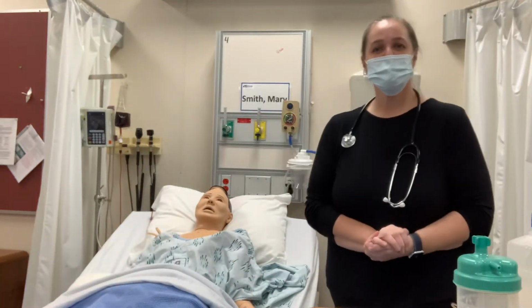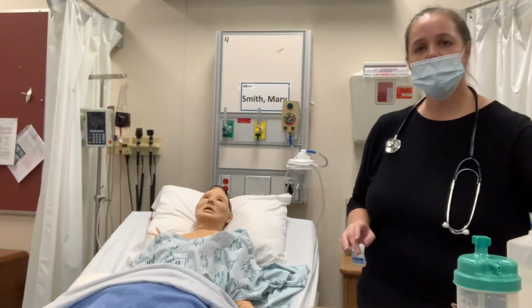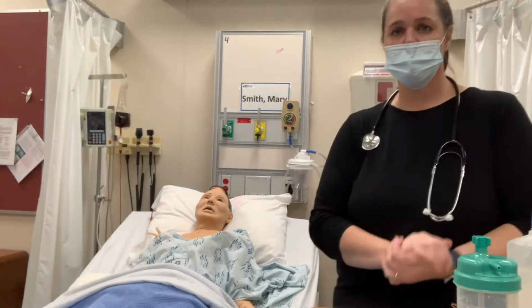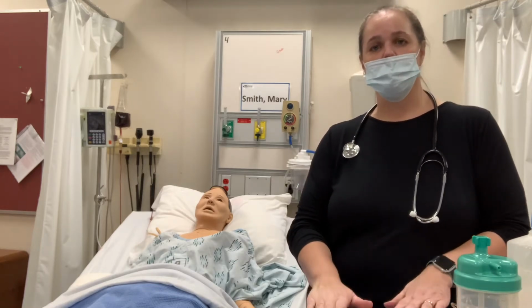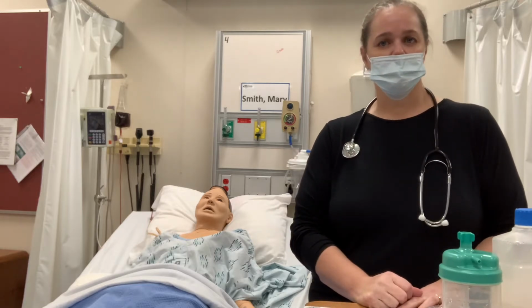Hi, my name's Andy. I am going to be performing the administering oxygen skill today. I've been given a scenario that says I need to apply oxygen at 2 liters by nasal cannula. I've looked at my patient's information. I have my protocol here with me, and I've gathered all my necessary supplies. So now it's time to go see the patient.